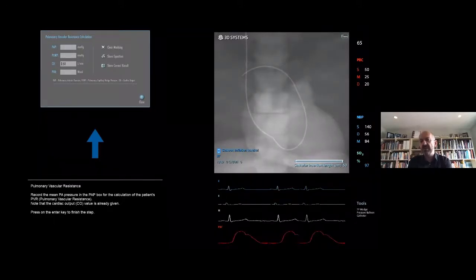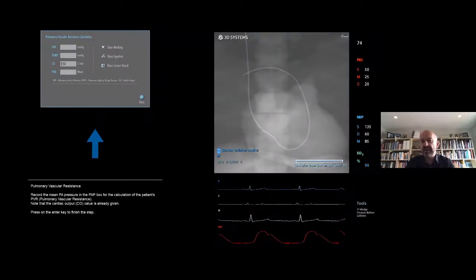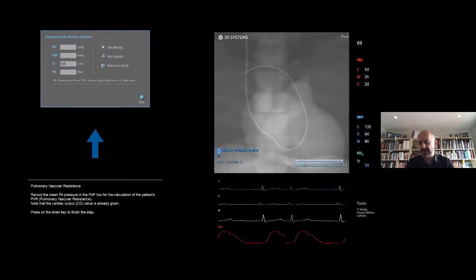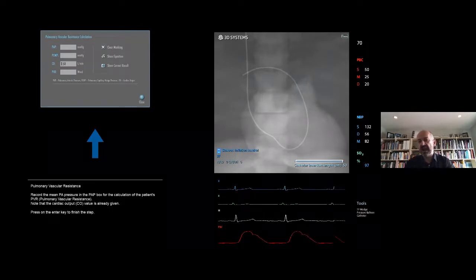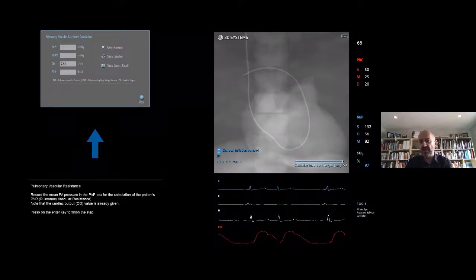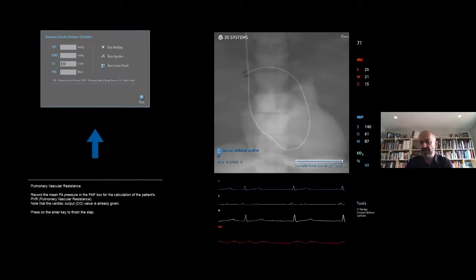When the balloon is down, the catheter is not wedged, and you go back to the PA pressure. So this is a very nice trick to help you determine you're not in some unknown position and you're close to the wedge. And if you now inflate the balloon up again, you'll see how your pressure will drop and the wedge comes back. So this is a good test to know where you're at. At this point, as you measure the wedge, the PA pressure, the RV, and the RA, you have to take the balloon down. You can't leave the balloon wedged for a prolonged period of time because you will get a pulmonary infarct.